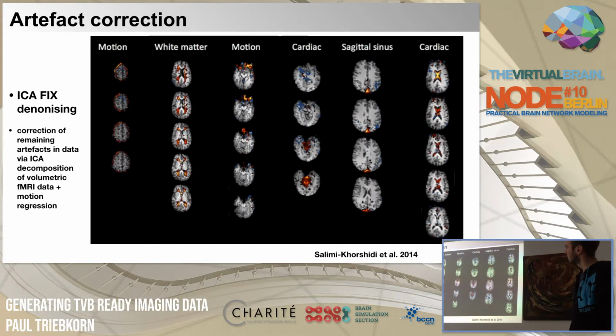Now, those were some artifacts in fMRI. However, there's still temporal noise in it. What do I mean by temporal noise? Well, there are certain components also distorting this time series, which are not of neural origin. So there are several other components in the signal we actually measure which are not neural, which we are not interested in, or which we don't want to analyze. And actually they make up quite a lot of the signal, and we have to remove them beforehand.